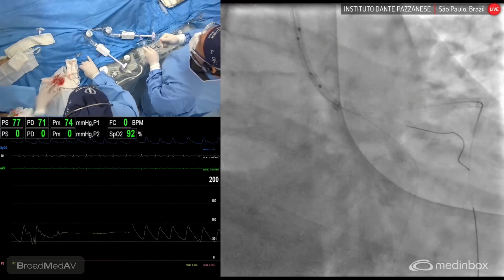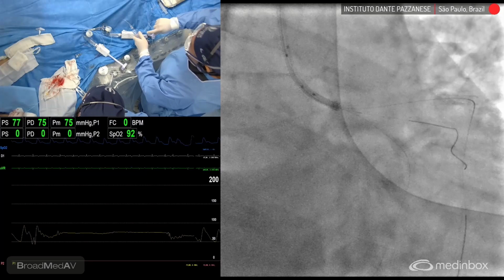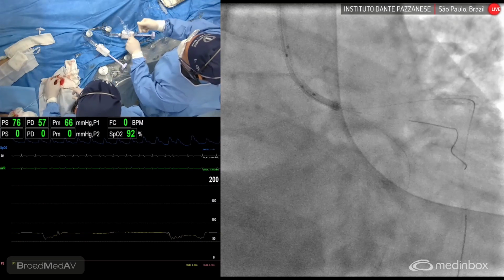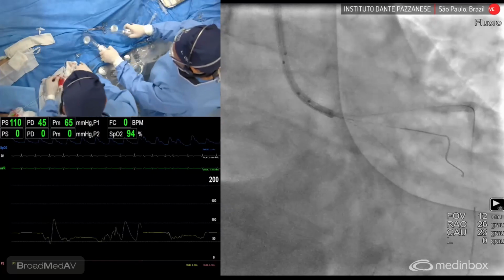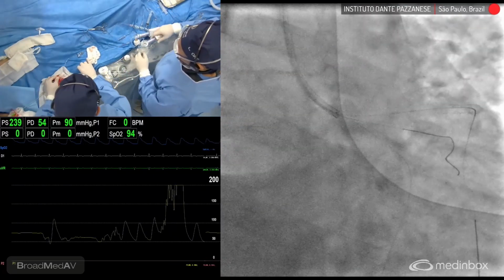So Rodolfo, which stent are you going to use here? A 4.0 by 18? 4.0 by 18, okay? Here's some angio here. So some control angio. Okay, the pressure is okay. Okay, everything's fine. So when we're dealing with this very sensitive location, we have to be very concentrated here.